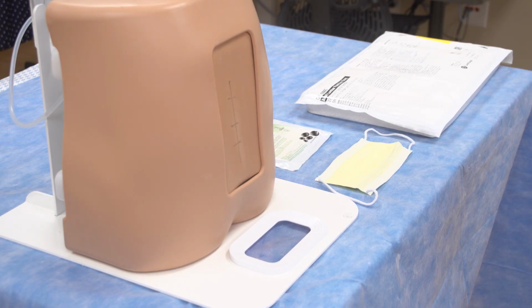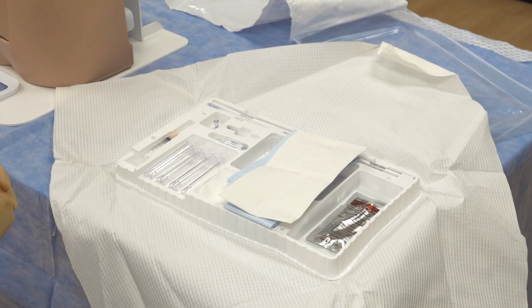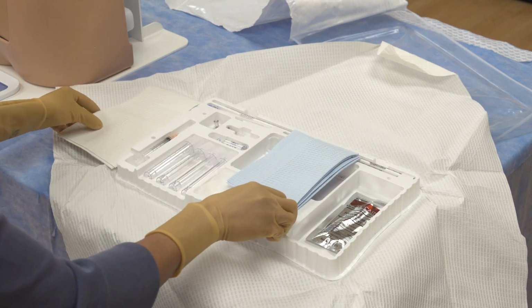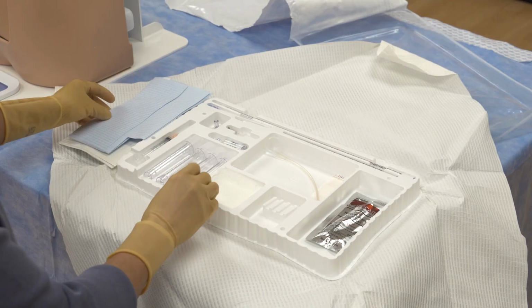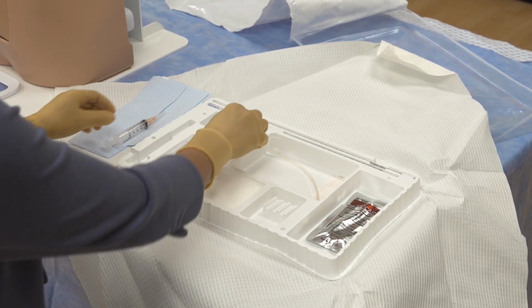Next, ensure a proper patient position with a rounded, flexed lumbar spine in either the seated or lateral recumbent position. Open the kit on a bedside table or next to the patient on the bed to allow for access to all the tools. Don a mask, then sterile gloves. Inspect the kit to ensure all components of the kit are present. You should have 3 needles, including a 25 gauge needle for skin anesthesia, a 22 gauge needle for subcutaneous anesthesia, and the spinal needle itself.